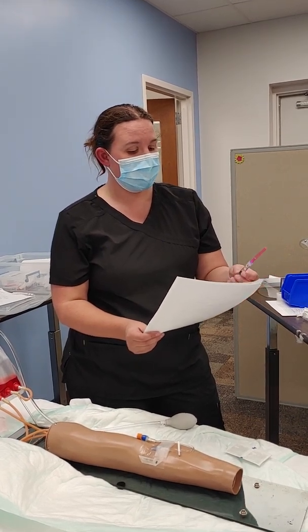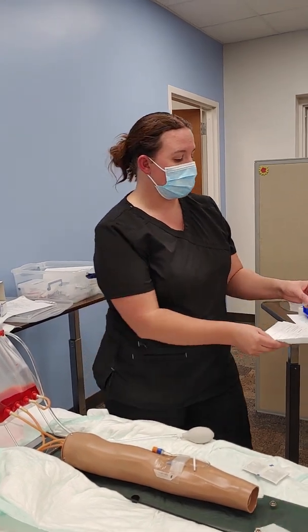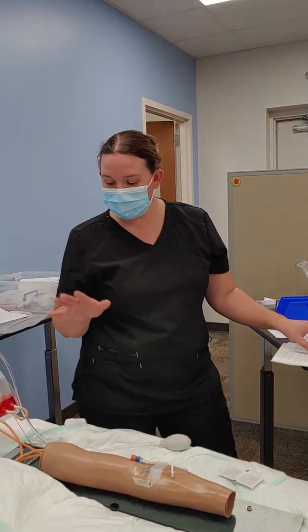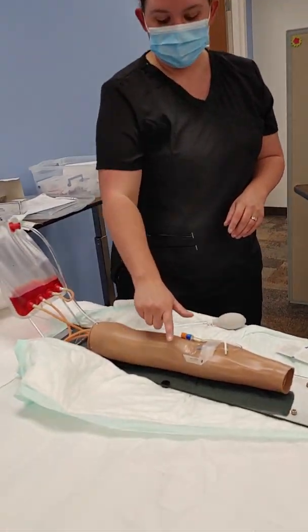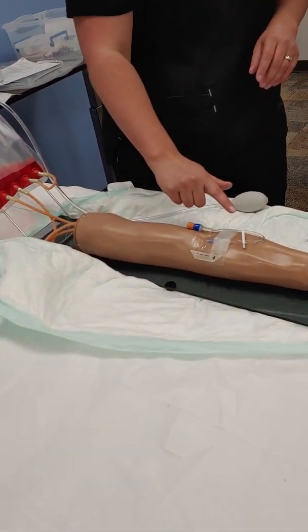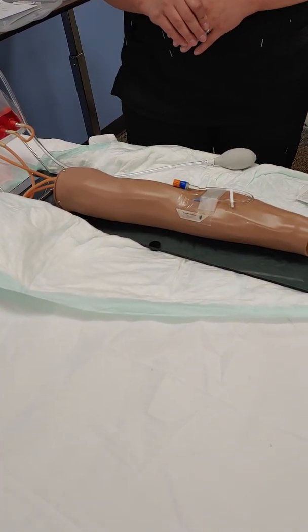I got your furosemide, 20 milligrams, which is 2 milliliters, IV push every day, and I'll document it at the end. Does that sound correct to you? Yeah, she's great. Assess IV site for inflammation or infiltration. Always assess your site before we push something through it. Make sure it's not red, swollen, leaking. We gotta make sure it's a good IV.